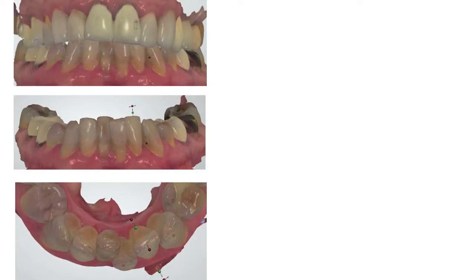So I'm going to give you an example, okay? Not TEDRA, a different patient. This is a patient that was going to have the 4 mandibular anterior teeth extracted, and 2 implants were going to be placed. Now, I have a lot of questions. When those 4 teeth are extracted, you see the crowding of those teeth? How many teeth are going back? Is it 3 teeth, or is it 4 teeth? Because the patient's not going to have orthodontics to expand the arch or do anything like that. So that's question number 1.